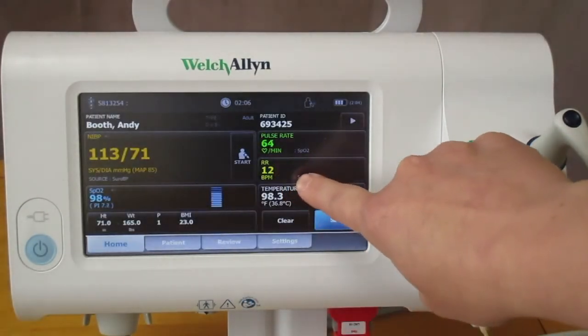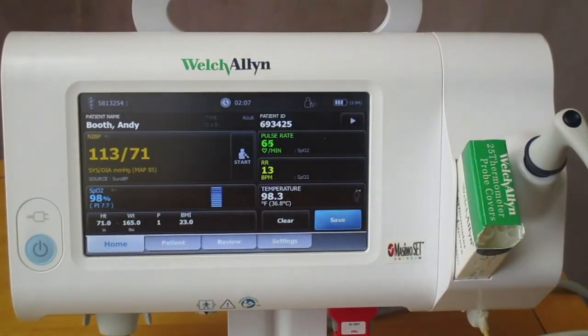When I'm back out to the screen, I can see that we have a respiration rate, so I can go ahead and remove the SpO2 sensor. And there you go.